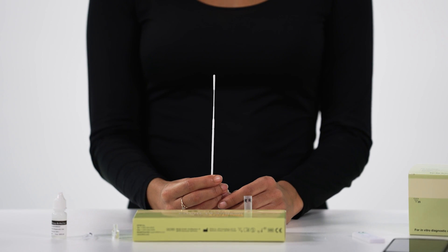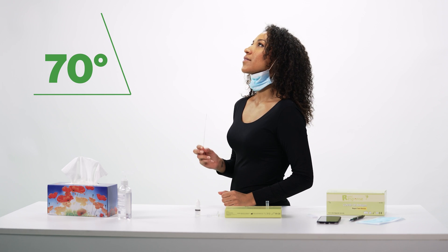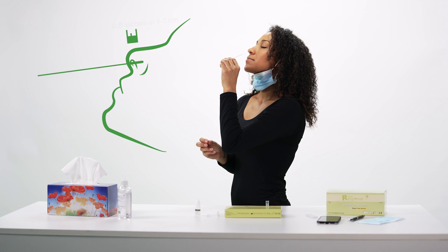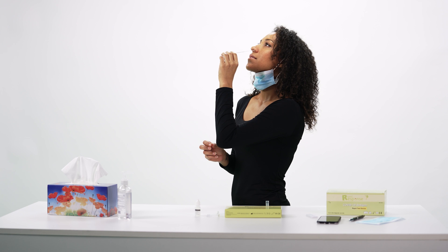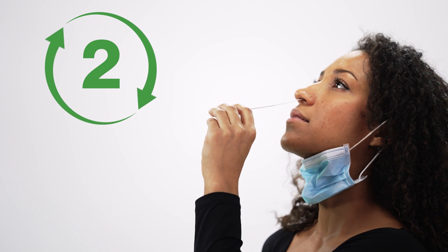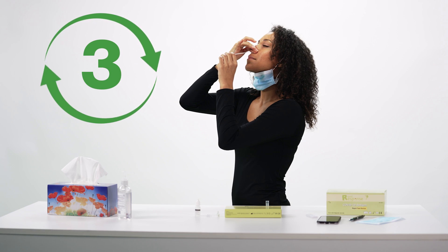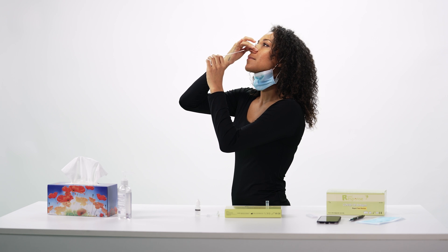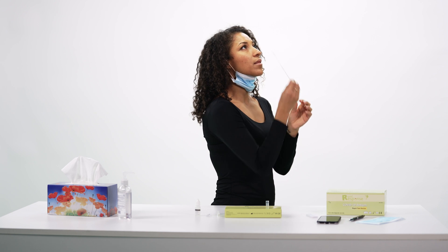Be careful not to touch the absorbent tip of the swab to any surfaces, including your hands. Tilt your head back 70 degrees. Insert the swab at least half an inch inside the nostril through the anterior nares until you encounter mild resistance. Using a circular motion, rotate the swab inside the nostril for five seconds. Press your nostril with your fingers to trap the swab tip and rotate the swab for five more seconds. Remove the swab from the nostril and insert it into the other nostril. Repeat the same steps on the other side using the same swab.